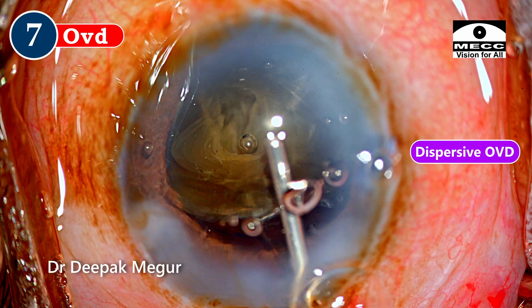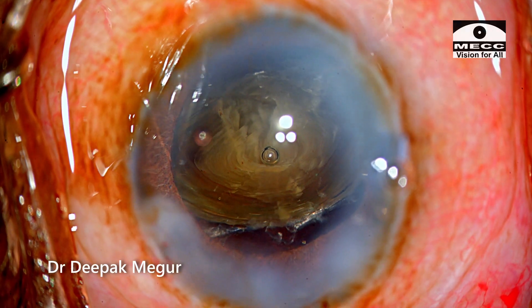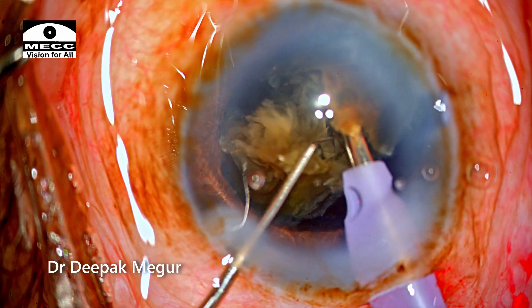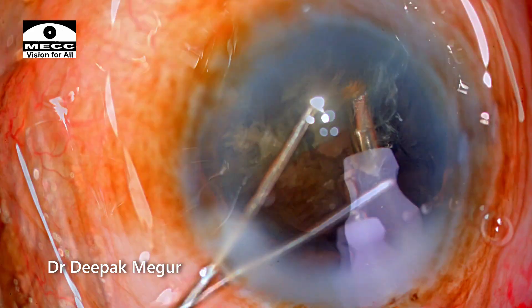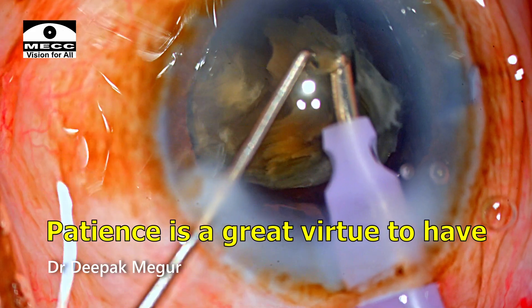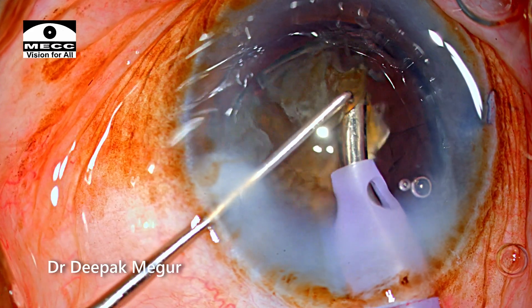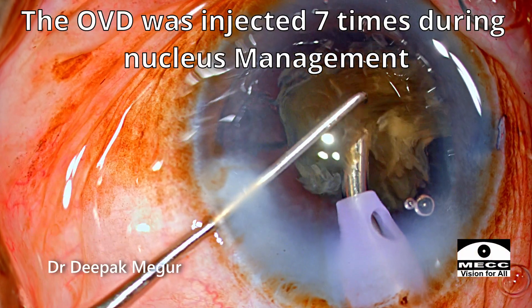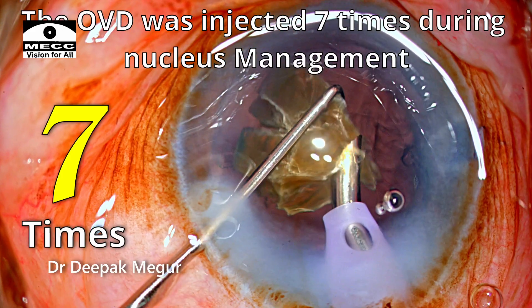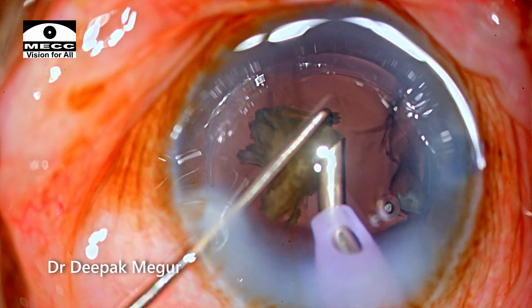OVDs are again replenished into the eye. The last fragment is quite large, so I am trying to divide it into two pieces, and each is then very slowly and carefully emulsified. This case took almost 20 minutes to complete. The greatest virtue one must have in such cases is patience — hang in there, be very slow and very gentle. After every fragment I come out and inject OVD. In this case I used two full vials of dispersive OVD and one vial of HPMC.